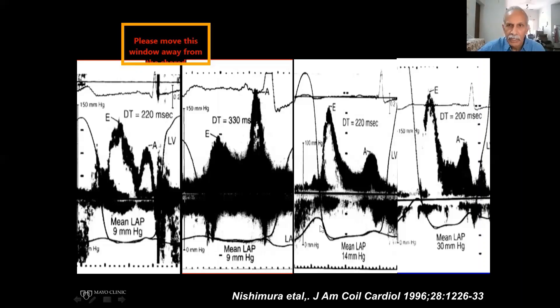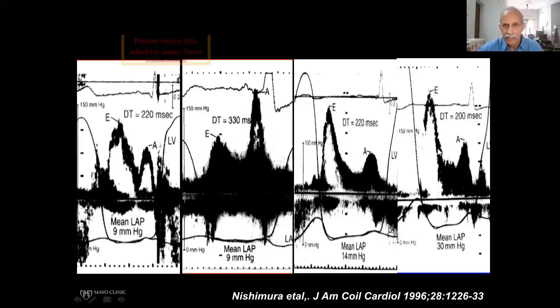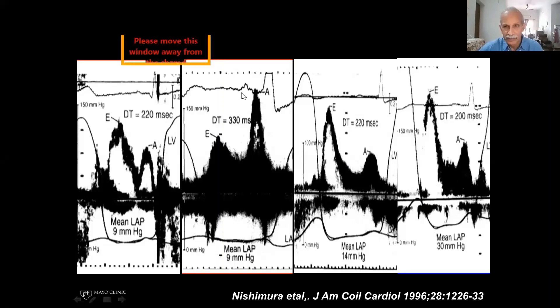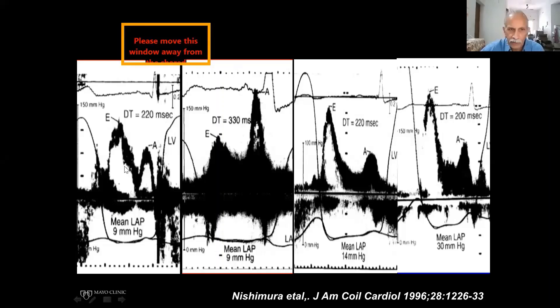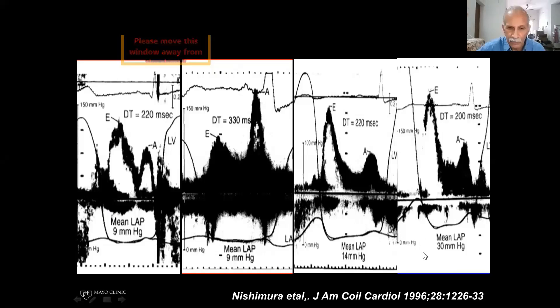When the pressure increases further, look at the baseline diastolic pressure also going up — here is 9, here is 14, now it's gone way higher. E-wave shows all a little A-wave, E/A ratio is greater than 2, and deceleration is getting short. This is going into restrictive filling. The Doppler profile and the Doppler measurements do correspond with hemodynamic measurements. That's the reason hemodynamic measurements are no longer made routinely to assess diastolic function, unless there's a disparity.